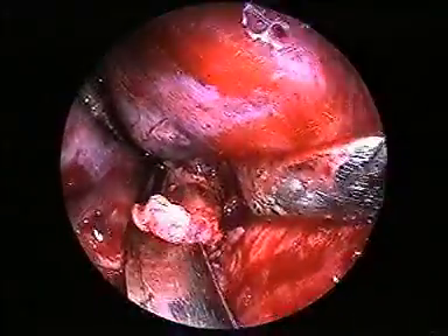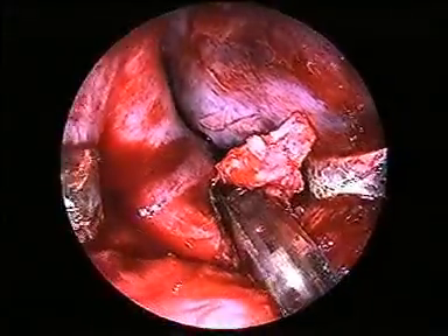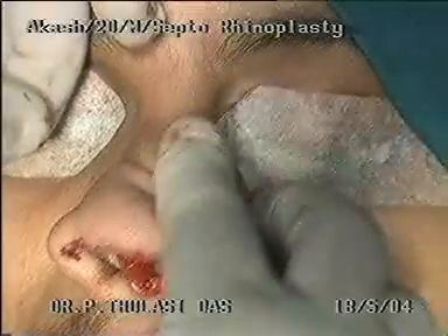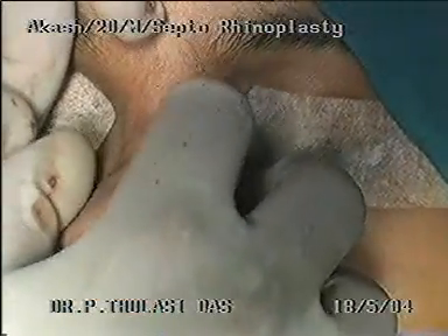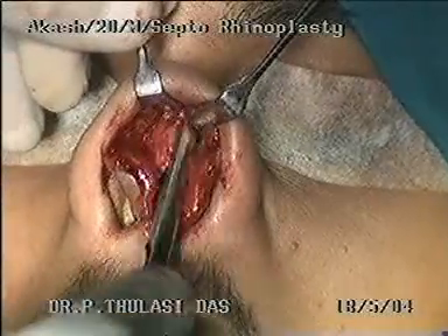The remaining part of the bony deviation and spur is removed by submucous resection. Replacing the flaps back in the midline shows a wide left nasal cavity. Since the bony part of the nose is fairly straight, osteotomies are not necessary. The bony prominence on the left side is removed by rasping.